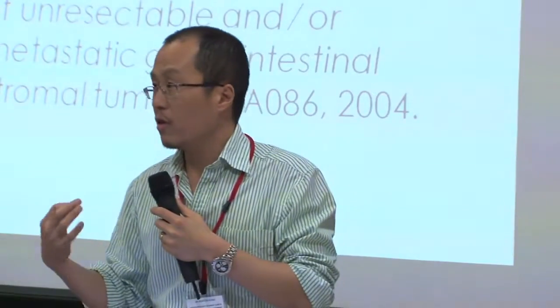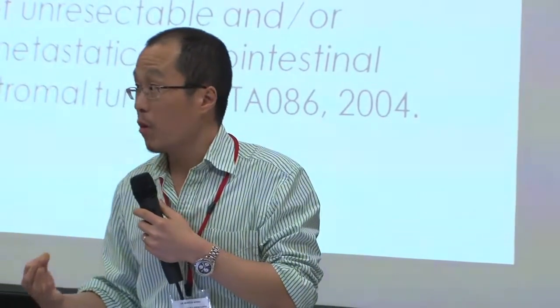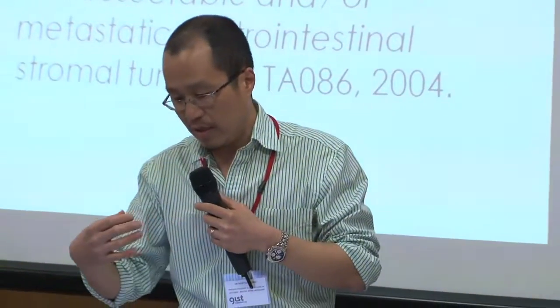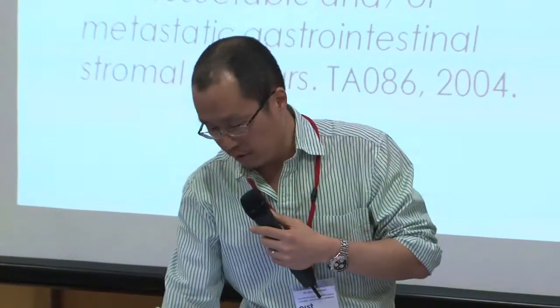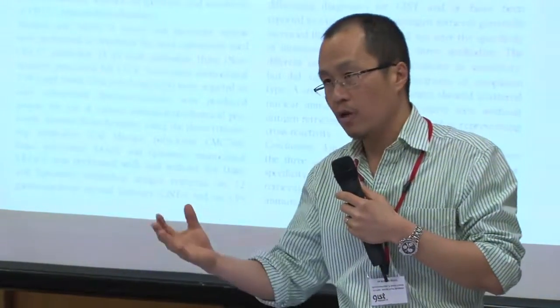Because of the crucial role of CD117 immunohistochemistry in diagnosing and guiding treatment of GISTs, lots of people did research, including myself, to refine how we actually do the technique and make sure we didn't get false results.